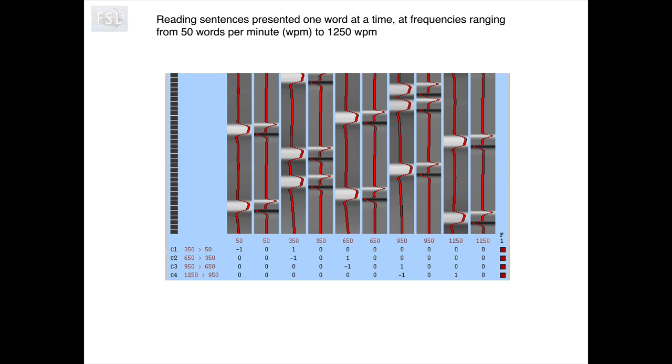As you can see in the design, we have 1 EV per frequency. We used temporal derivatives, and the contrasts that we have are for the differences between different frequencies. You are then asked to think about what the F contrast means. So what are we looking at when we set up the F contrast? If you don't know or don't remember, you can check in the lecture, or there is some hidden text in the practical that you can check.